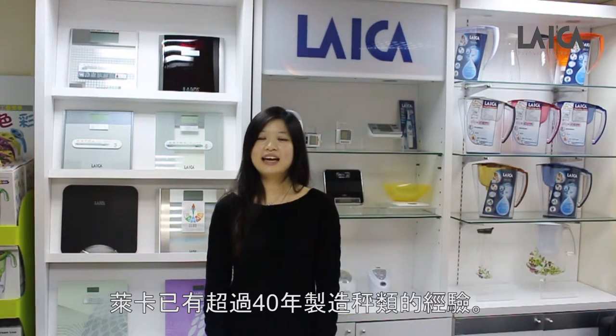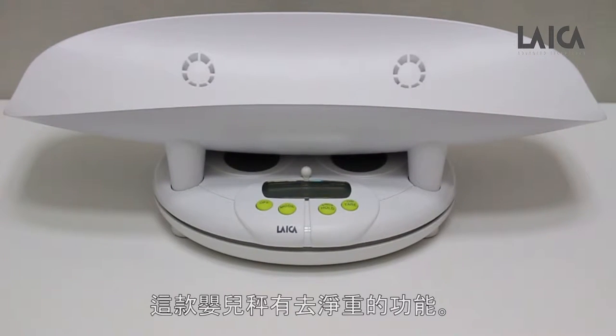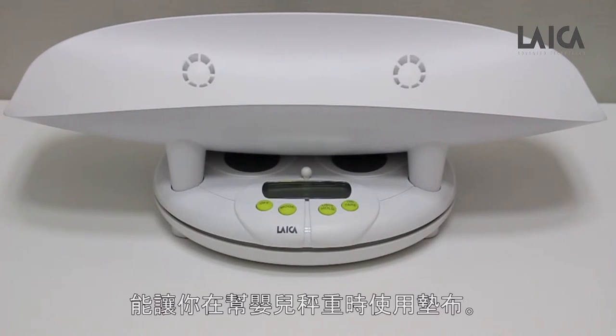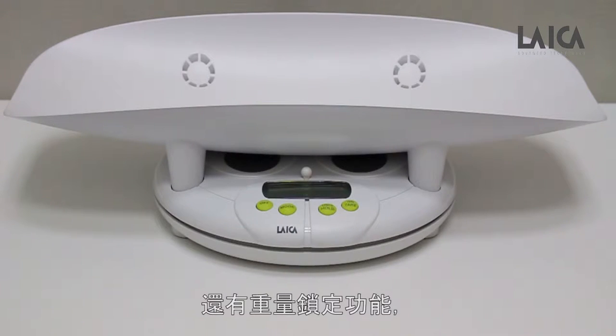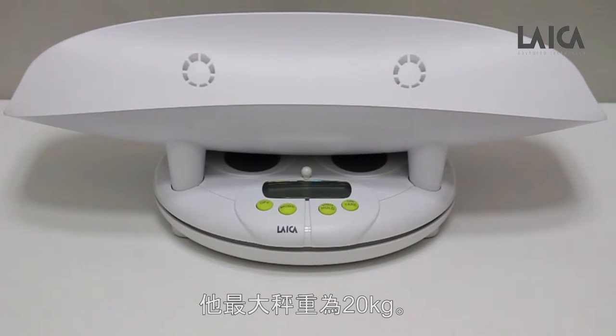Hi, as you know, Laica has been making scales for over 40 years. Today I'm going to show you the Laica electronic baby scales. This scale is designed with a tare function, which allows you to weigh the baby using a soft towel. It also comes with a weight hold function that allows the steady weight to be displayed even when the baby is wriggling around. The maximum capacity is 20 kilograms.